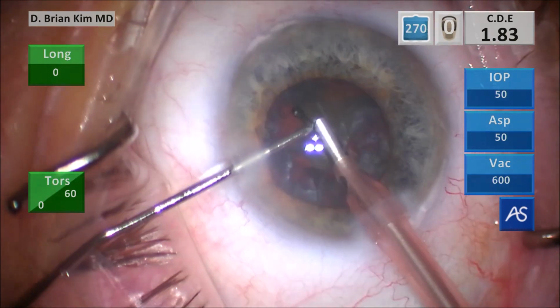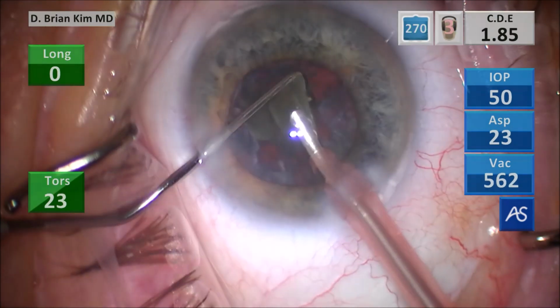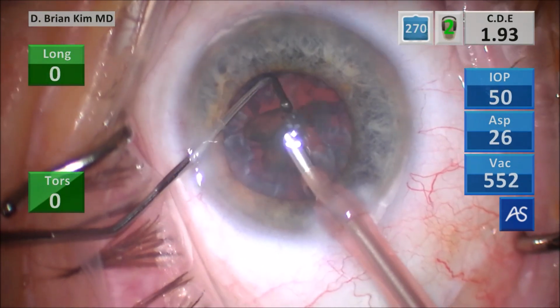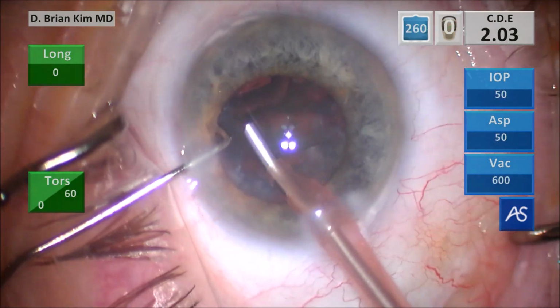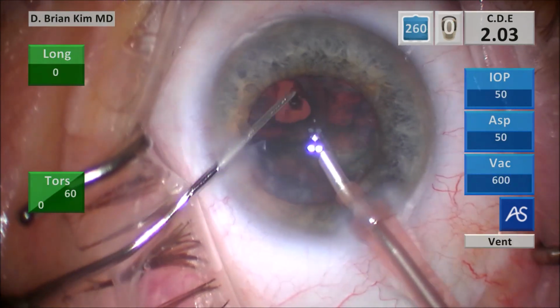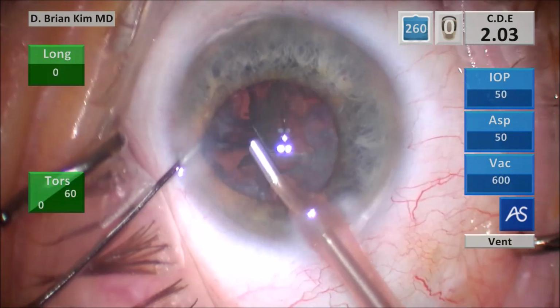Very carefully, I'm pulling the pieces up out of the bag with the chopper instead of going after it with high vacuum. In this way, it's a very, very controlled way of getting lens pieces without getting that phaco tip, which has high vacuum and might grab the iris.